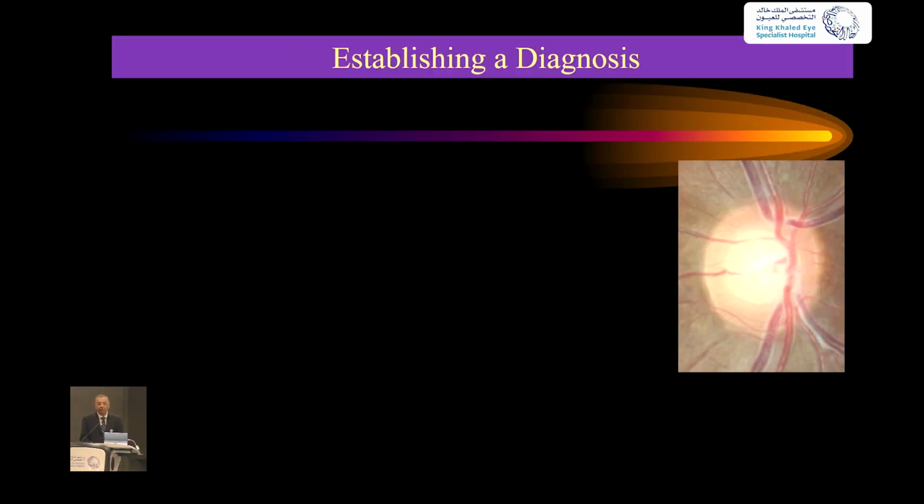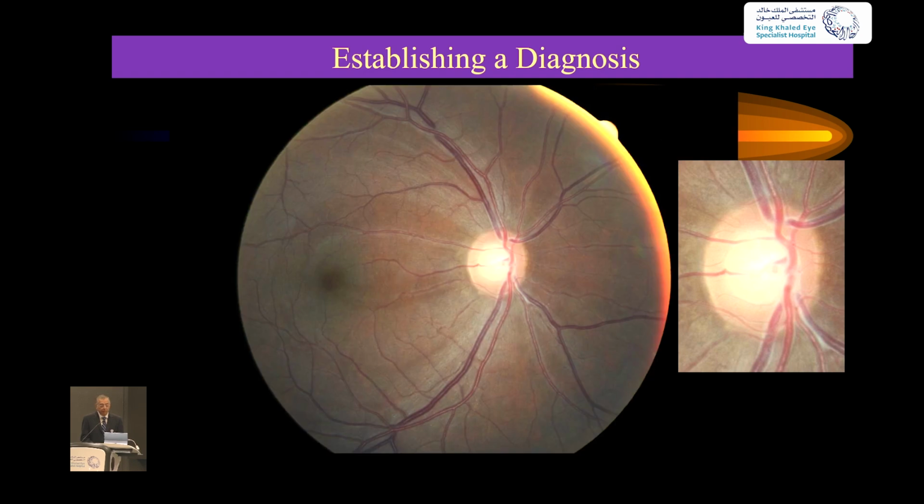Last couple of points. When I was getting trained in glaucoma, we were trained to look at the disc. We were trained to look at the slope of the disc, the cupping, the shape, the bayoneting, the vessels. But then later on, we learned, look at a bigger picture, right? Look at the nerve fiber layer losses. But what I did not realize until just 18 months ago was that what I have been looking at as glaucoma and glaucoma progression may not even be glaucoma.